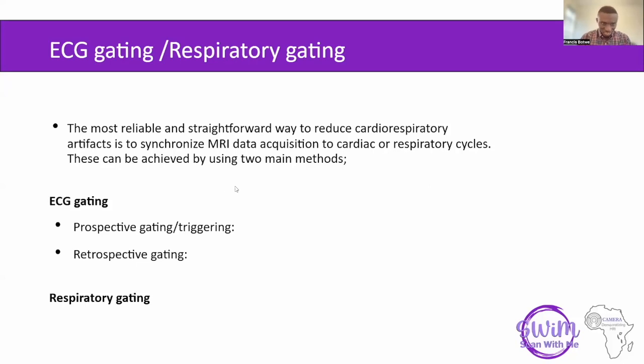All right, so let's move on to gating. As I said, cardiorespiratory movement are the main artifacts that we are very concerned of.